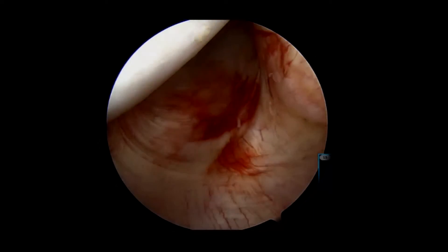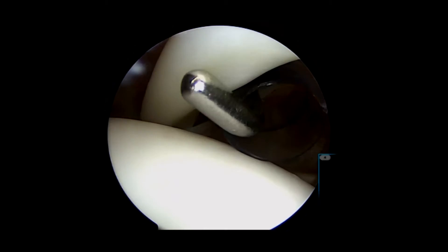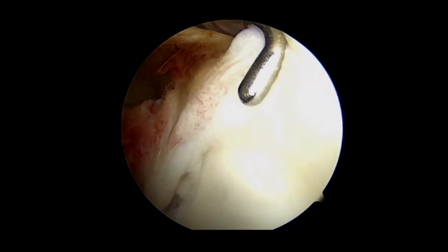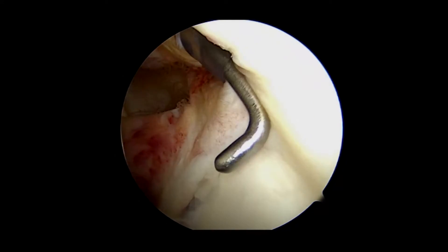The arthroscope is then placed into the inferior axillary recess to evaluate for loose bodies. The bicep tendon is then probed to evaluate for stability, followed by probing the superior labral complex and bicipital root.